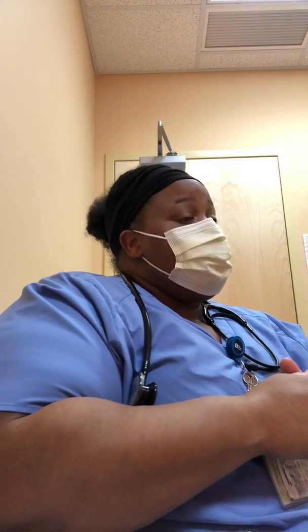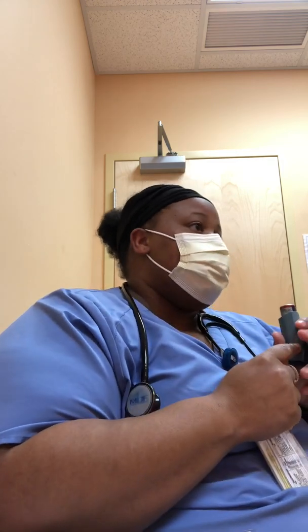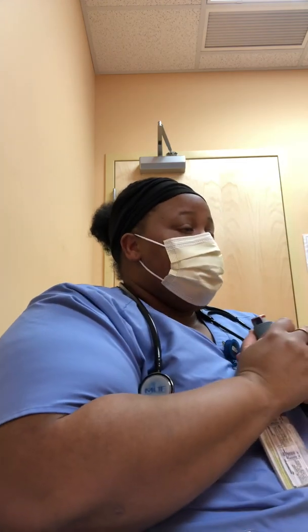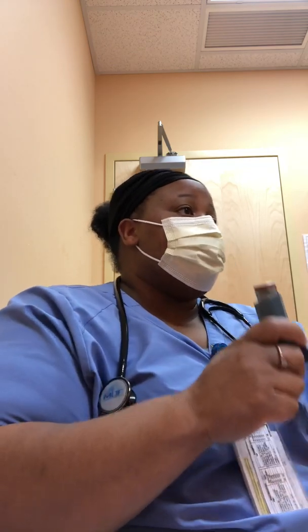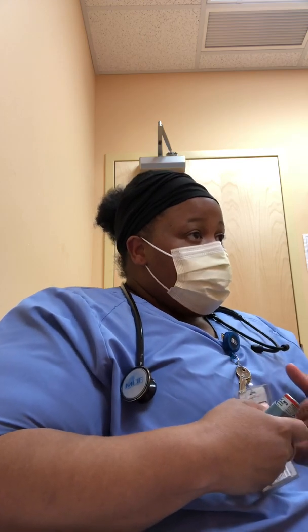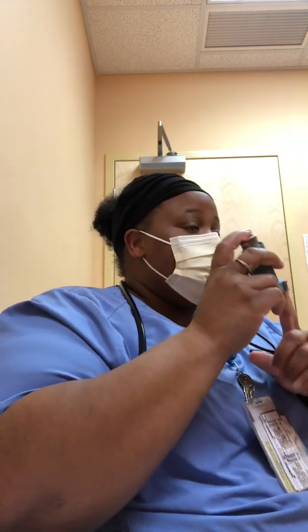I also go over that it can be used with a bronchodilator, which, ta-da, is this. This is your rescue medication. This is not to be taken every day. Again, I ask the patient and the parent, what is this medication for? This is not for everyday use, but this is the rescue medication. If you feel like you are belly breathing, short of breath, and can't catch your breath, you would take the 2 puffs of the Flovent daily, morning and night, what the doctor ordered, but you will also add this at the time that you need it. You will be getting sent home with both. It's a combination that treats and manages your asthma.